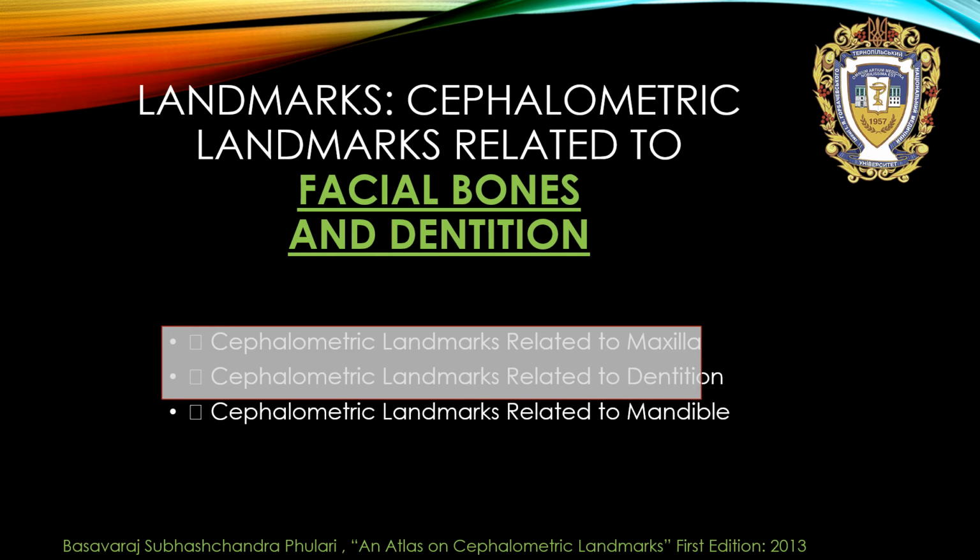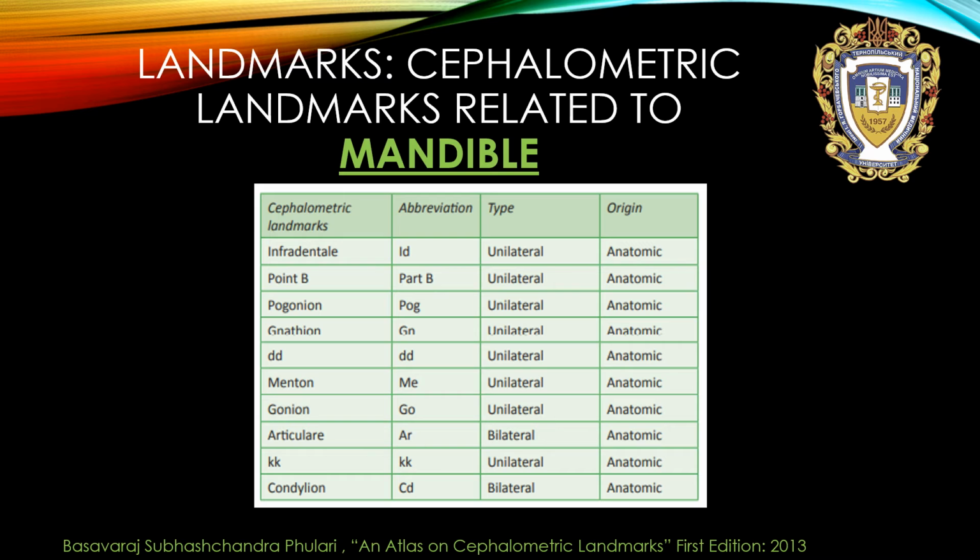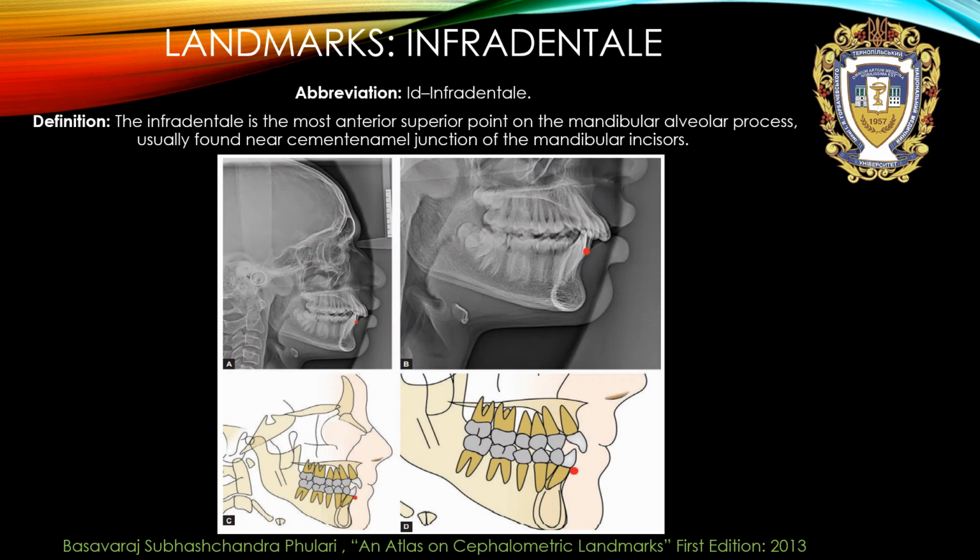And cephalometric landmarks related to mandibula. On mandibula, there are present many different points, and the most important are next.